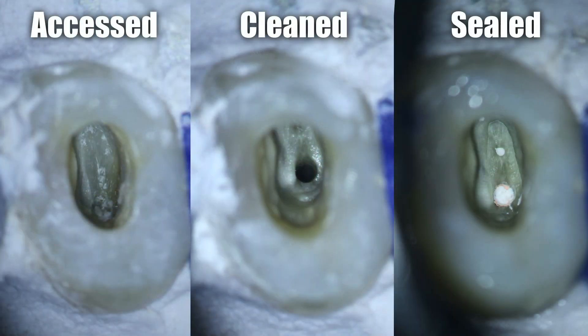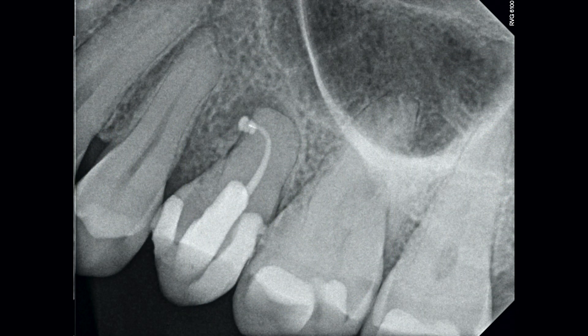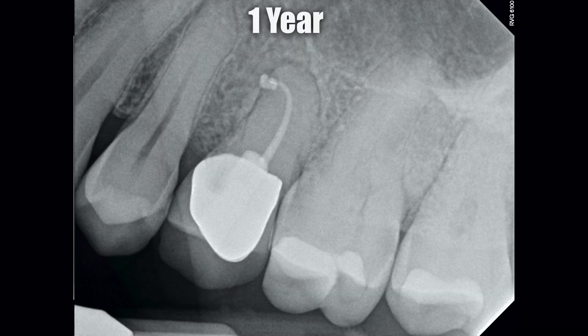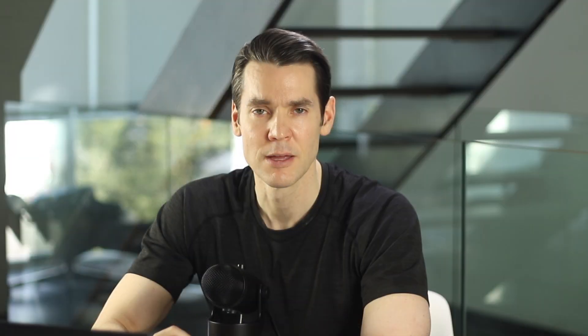You can actually see my attempt to identify that second canal in that obturation photo. I closed the access with a dual-cure bonded resin and referred the patient back for the final restoration. At one year, we see the tooth has been restored properly, and we see full resolution to the apical pathology on this two-dimensional projection image.